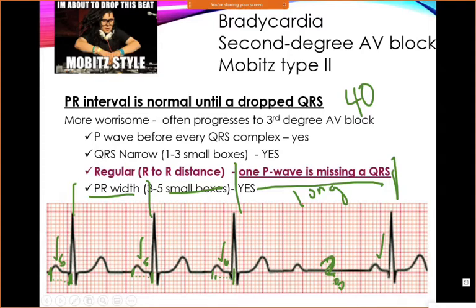This could be either first degree or type 2, depending on how you're reading it. I think I was reading this one just to the Q, not to the RS. So let me go back and read this appropriately. I'm not marking these appropriately.